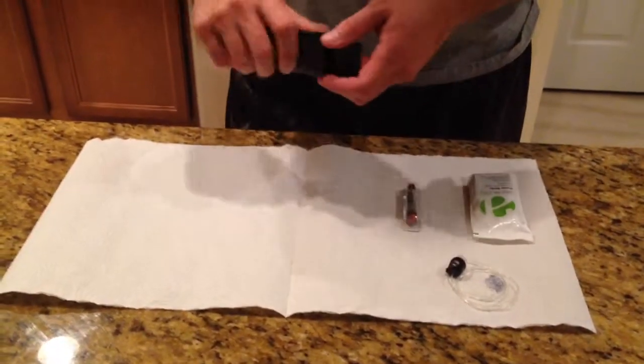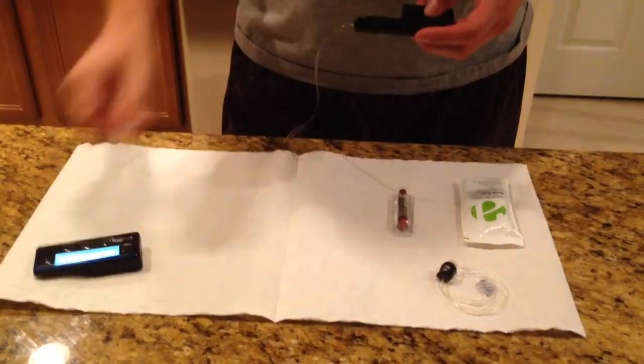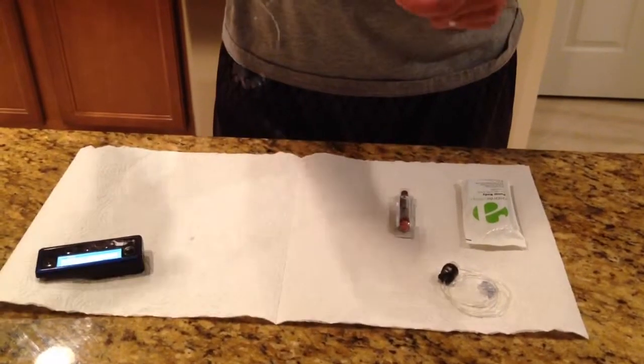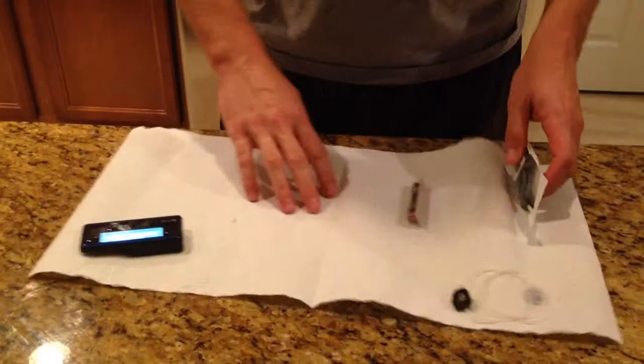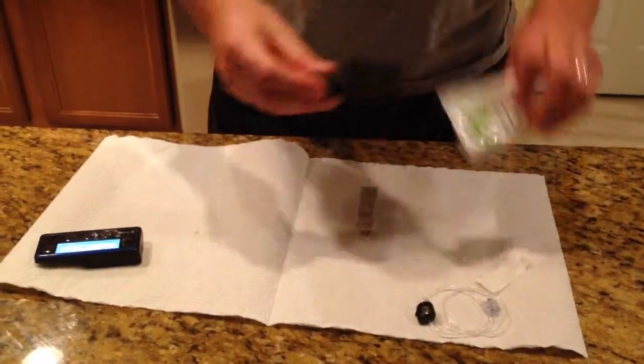Hey guys, I just finished the cartridge on my snap insulin pump. I'm going to show you guys how quick it is to change. So this is gone — no more insulin in this. Put this over to the side. You can recycle that or throw it away, and grab a new pump body.